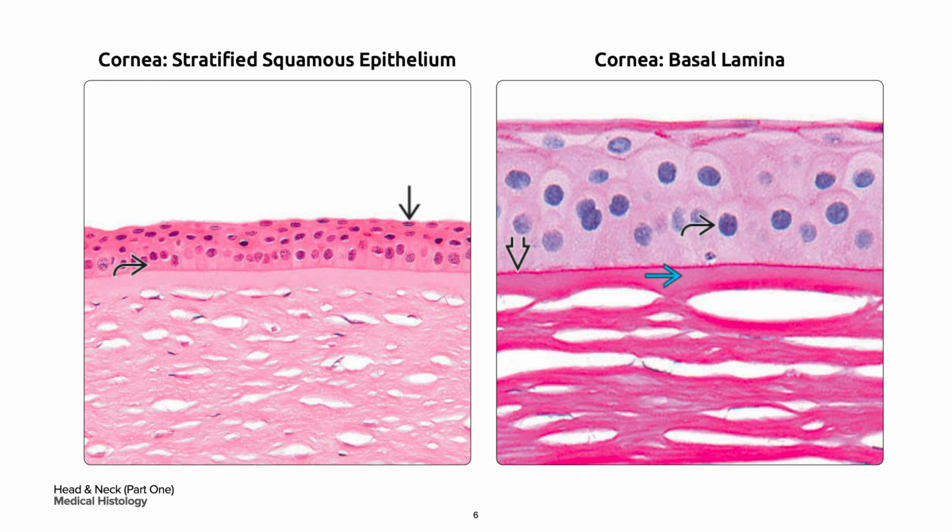On your right is the corneal epithelium in the curved black arrow that rests upon a thin basal lamina, which is stained bright pink in this periodic acid-Schiff preparation in the bold black arrow. The acellular band beneath the basal lamina is the Bowman layer, pointed out in the blue single arrow.